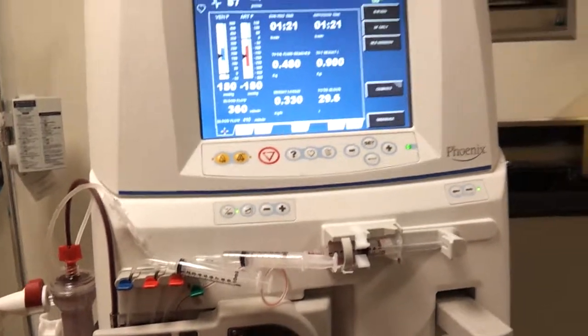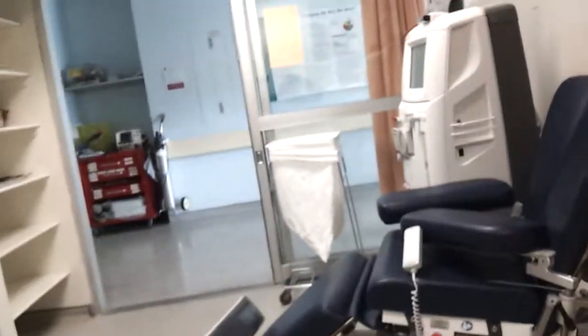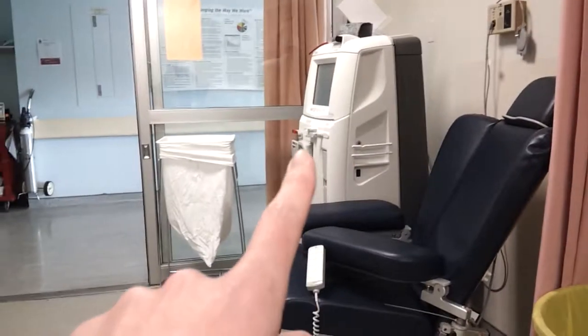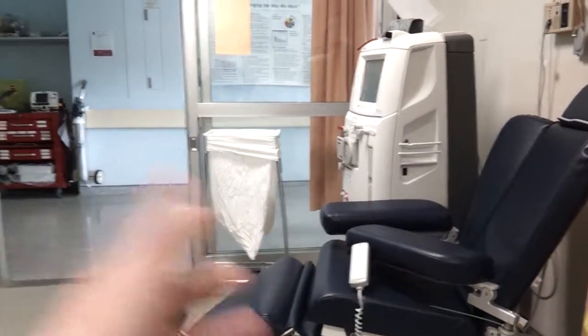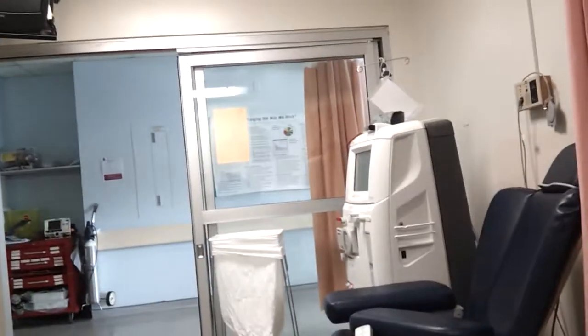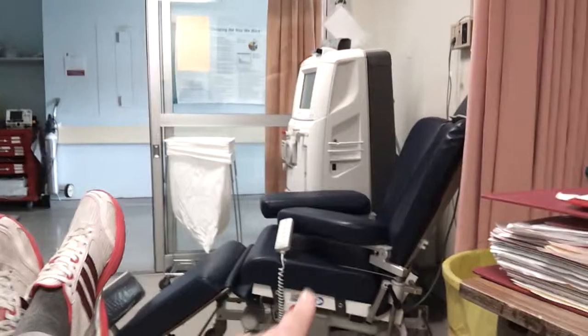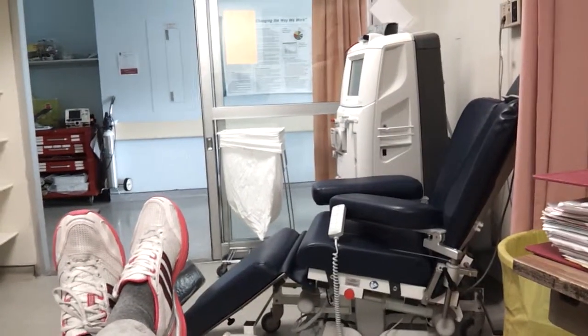It's definitely difficult sitting in a chair like this or actually this one right across from me. I'm in a room right now that's private. Normally I'm in a main unit with a bunch of people, but sometimes we get stuck in these little rooms. That's actually the dialysis machine there. It's pretty big. It's about 400 pounds, I think. And this is what the dialysis chair looks like right here. Well, that's what an average dialysis chair looks like.